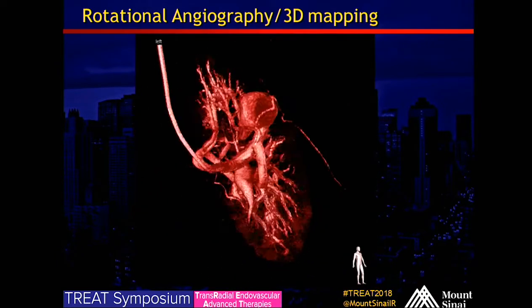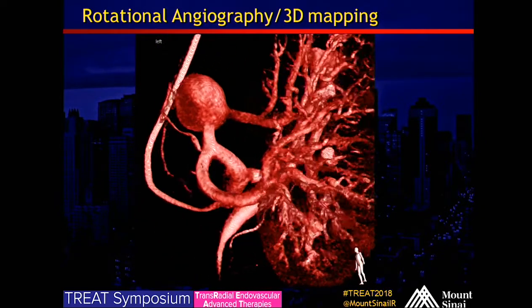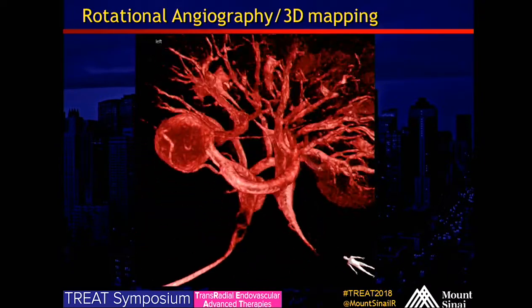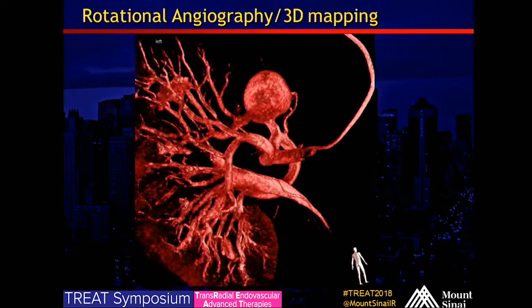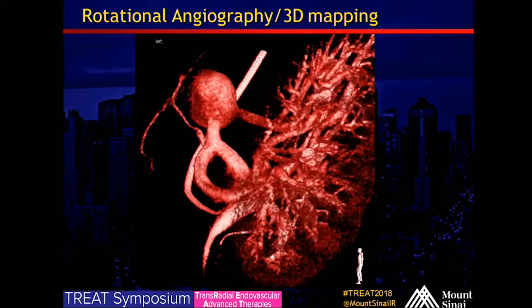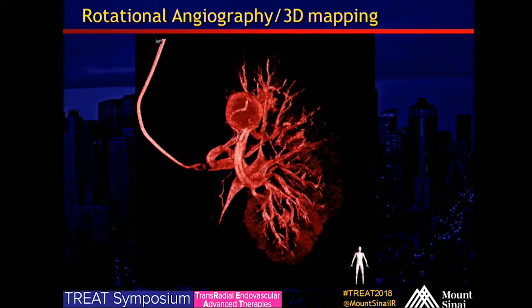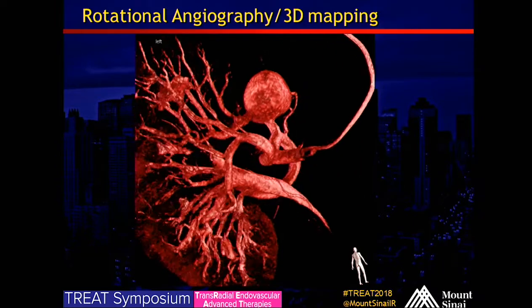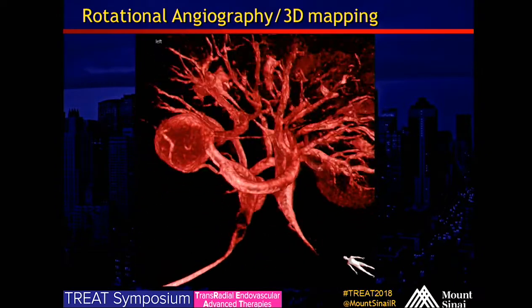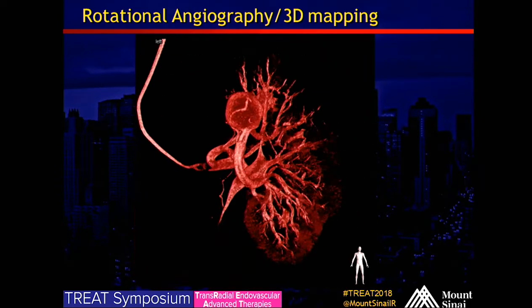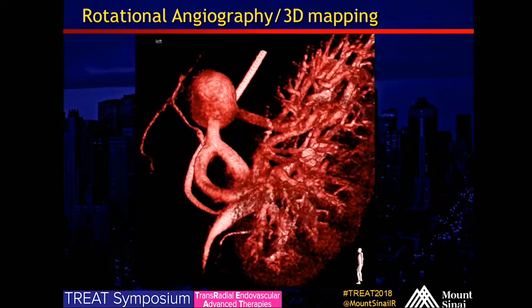The way I'm interpreting this anatomy is that there is a single branch vessel feeding into this aneurysm. It's a fusiform aneurysm — I don't think there's a perceptible neck — and there is a single outflow supplying the anterior upper third of the kidney. The renal artery bifurcates into an anterior and posterior moiety, which is very common, and this is specifically off the upper pole anterior moiety.